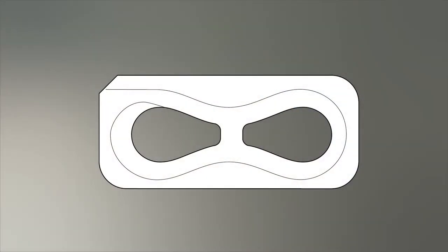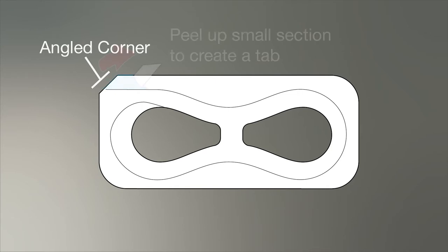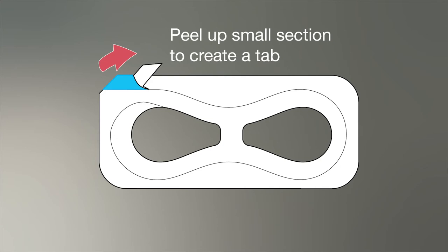Remove the adhesive overlay from the packaging. Locate the angled corner of the overlay. Prepare the overlay by peeling up a small section of the top white liner to create a tab. This will help you to remove the top white liner later.